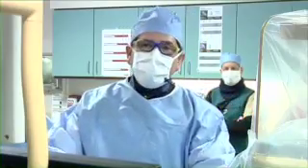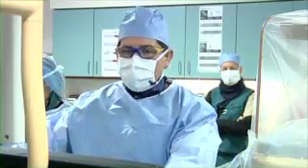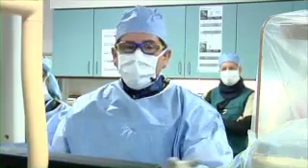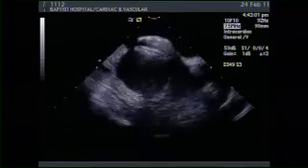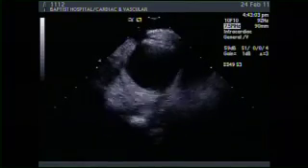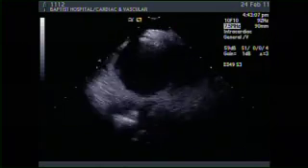As you can see here, can you show my hands for a second, please? This catheter here is the ultrasound, and this catheter is put inside the heart, so I don't need to do any anesthesia. We pull the catheters out as soon as we finish, and these patients stay in the hospital for 23 hours, and they go home.